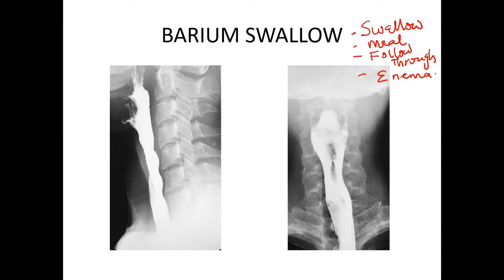Usually, there are various indications for barium studies. If you are doing barium swallow, the aim is to outline the esophagus and sometimes the upper part of the stomach. And the common indication for barium swallow is in patients with dysphagia from any cause. It might be dysphagia from stricture, dysphagia from a tumor, dysphagia from achalasia.